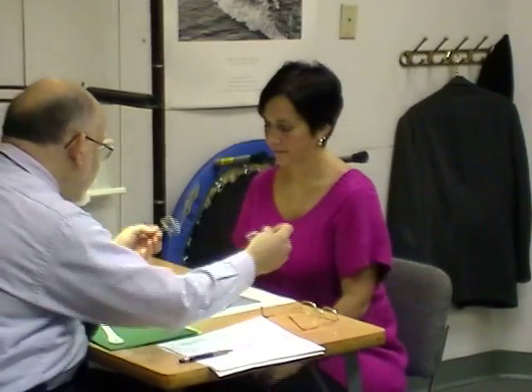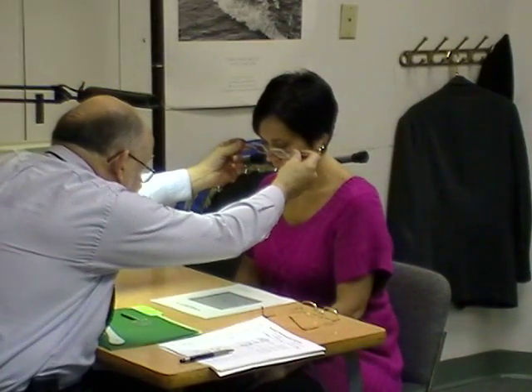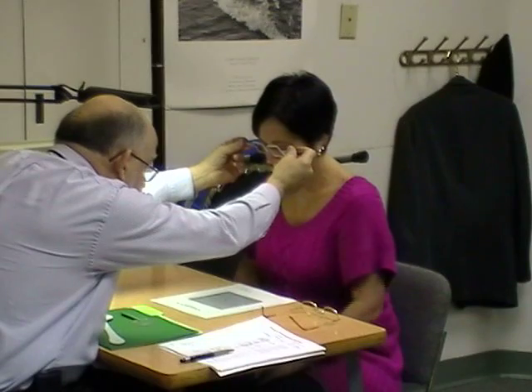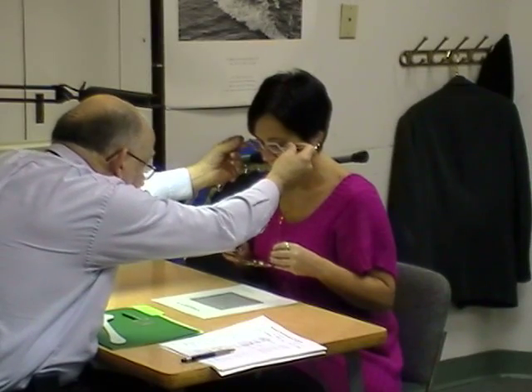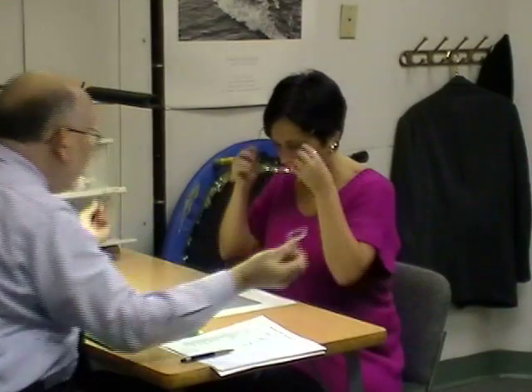We're going to try some handheld prisms here, because this has become a question. These are prisms based down. Tell me if that... Yeah, a little better? That's a little better there. Now grab the lenses — we're going to switch. Is there a qualitative or quantitative difference between the base down and the base in? Which is better? That one. The base down? Yeah, definitely. Definitely better base down. That's interesting. I'm glad we did this, because that has become a question among my colleagues who are doing this and also with some of the demonstrations we've done.